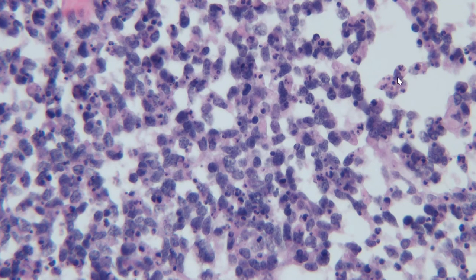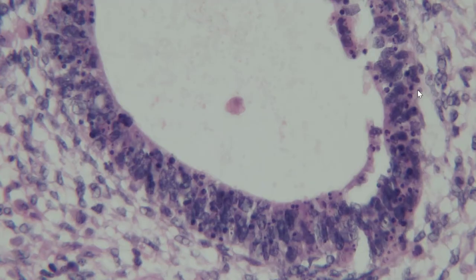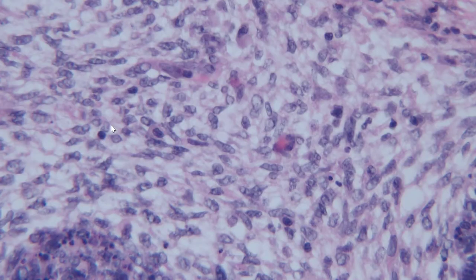cell death or apoptosis. Here is a view of the epithelial structure that we saw from low magnification, and although it's making this tubular epithelial structure, they still appear to be malignant cells, and the cells are not terribly different from the blastema that we saw earlier, with abundant nuclear debris. And here are the stromal or mesenchymal cells present between the blastema and the epithelial structures. So they have more elongate nuclei and they're growing in more fascicular arrangements.